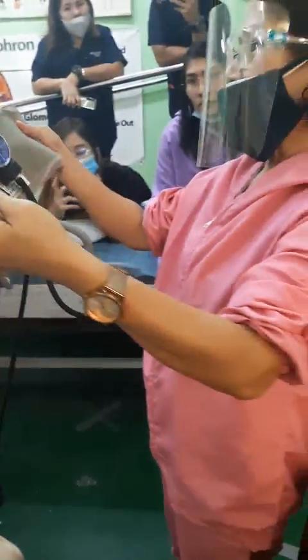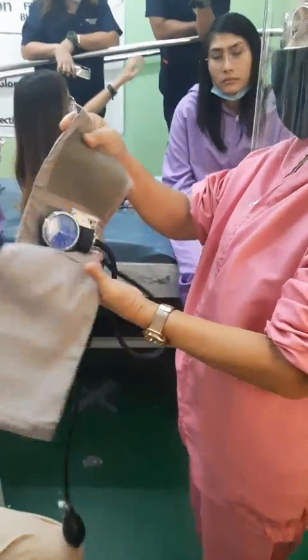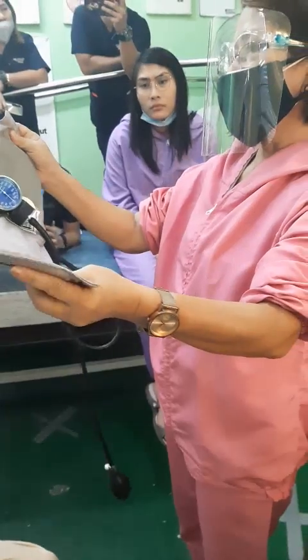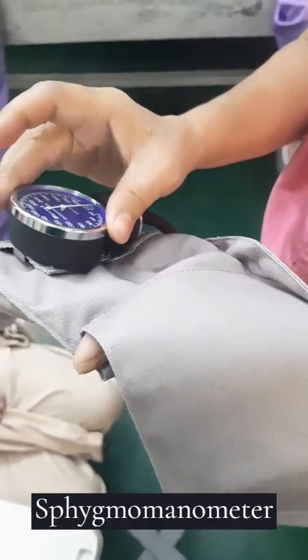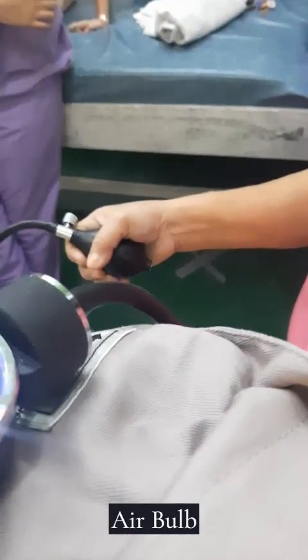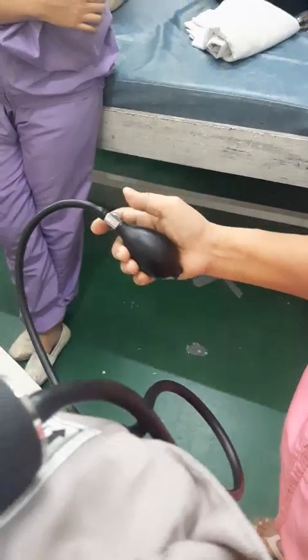I should first introduce to you the parts of the BP apparatus — the sphygmomanometer. This is your BP apparatus. On the right is the indicator. And this is the air bulb, B-U-L-B. This is the BP regulator — or blood pressure regulator.